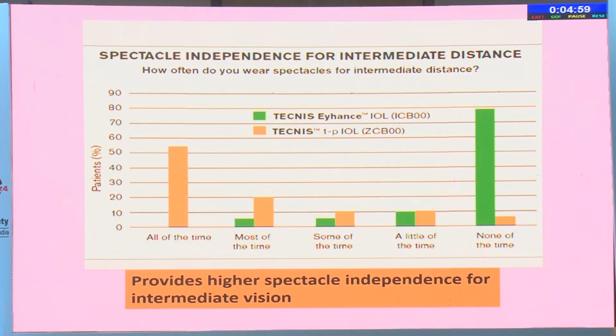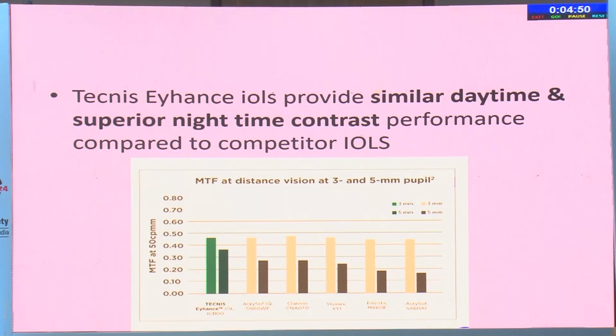It provides higher independence from spectacles as far as intermediate vision is concerned if we implant the lenses bilaterally. And the night vision problem or the contrast is even the same as the monofocal lenses.